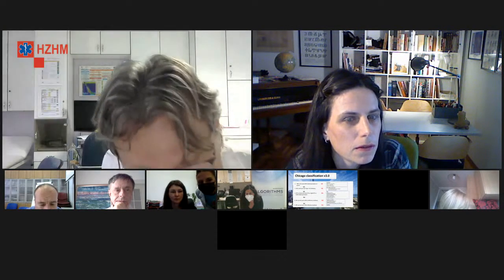Nadovezao bih se na ovo pitanje o konvencionalnoj i high resolution manometriji.